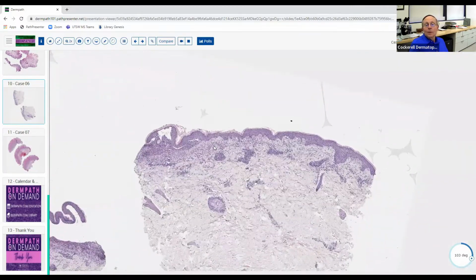And just, again, remember the differential diagnosis and how you work through a case of subepidermal blistering. Ask yourself whether it is inflammatory or not, which you did, which is good. Then ask what kind of inflammation is beneath the base of the blister and in the blister space. If it's neutrophils, it's some of those diseases. If it's eosinophils and lymphocytes, mostly it's usually bullous pemphigoid, maybe a weird bullous drug eruption. So just work through it that way, and you'll be able to come up with a differential.